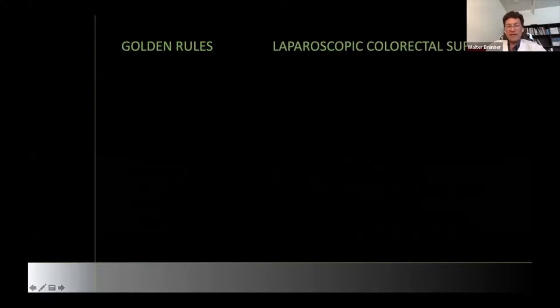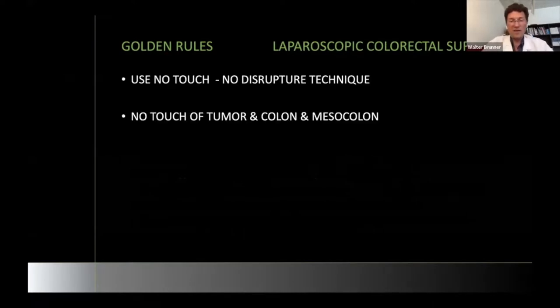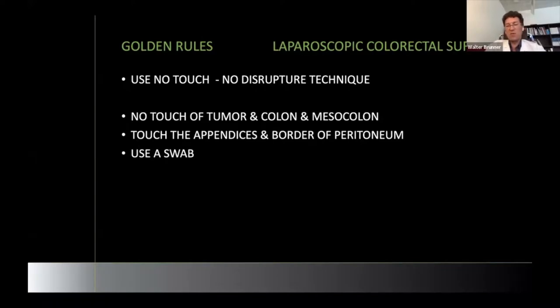Another example: I put a swab behind, so if I go through I don't rupture it. One instrument, very gently lifting up. For the tubular resection since it's not oncological, I still want no bleeding — grab it once with a fine instrument. For the right side: overview, organ placement, always look for other disease such as carcinosis. Always start with the omentum and place it over the liver. Do necessary adhesiolysis. The small bowel should be in the left upper quadrant. You should see the aorta and the right side — even in fatty patients this is possible.